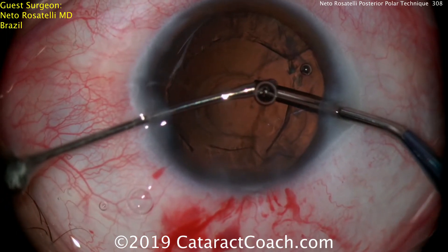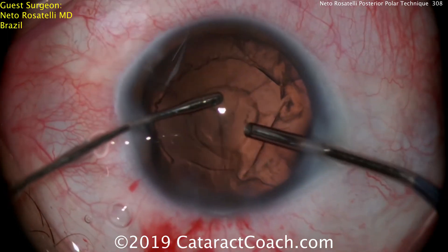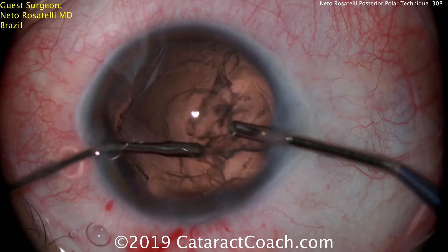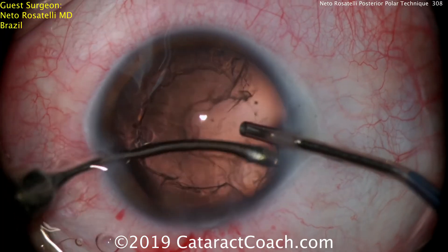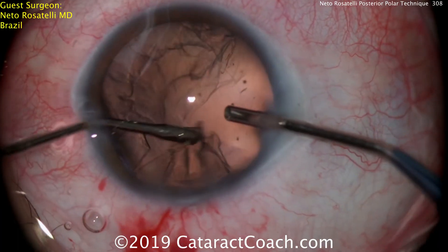Now bimanual irrigation-aspiration to remove the cortex. The epinuclear shell has already been removed with his innovative technique. Going around to remove the cortex in a nice circumferential manner. Note that he's staying away from that central posterior capsule.